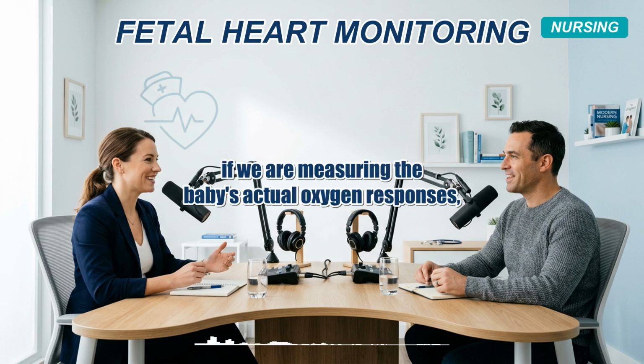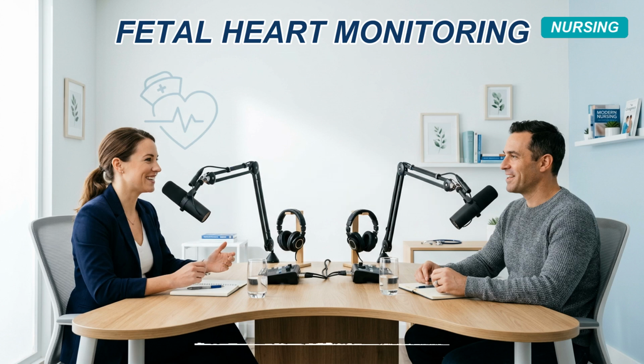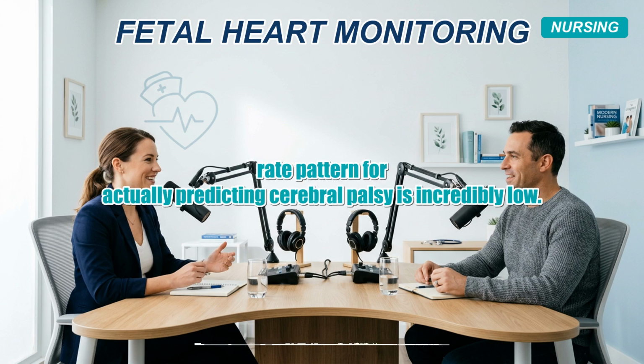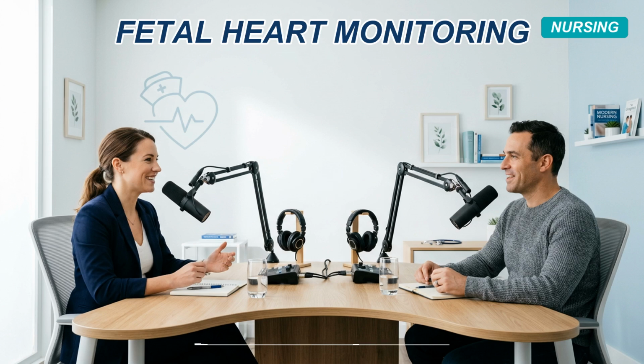Wait, if we are measuring the baby's actual oxygen responses, how is it possible that this doesn't prevent brain injuries? Because the positive predictive value of a non-reassuring heart rate pattern for actually predicting cerebral palsy is incredibly low. Okay, so what does that mean practically? Essentially, a drop in heart rate doesn't automatically equal irreversible brain damage.